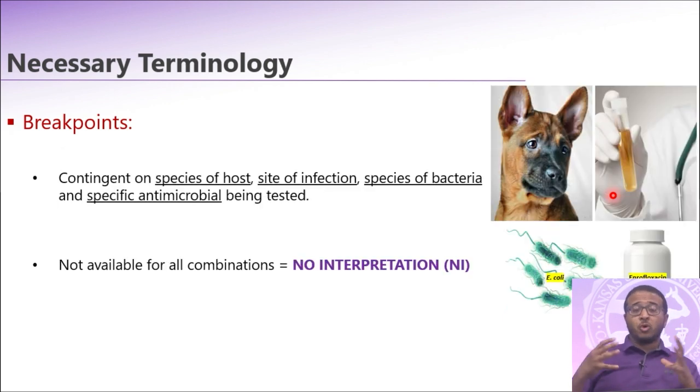So all these data that come together, these breakpoints are contingent on contributing factors from 4 different sources.